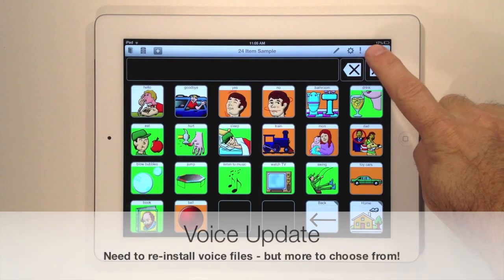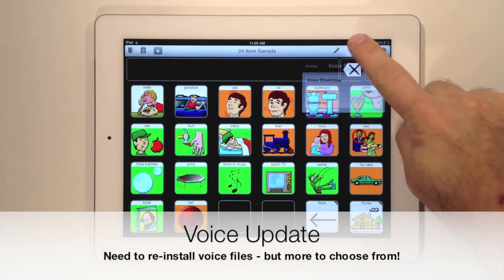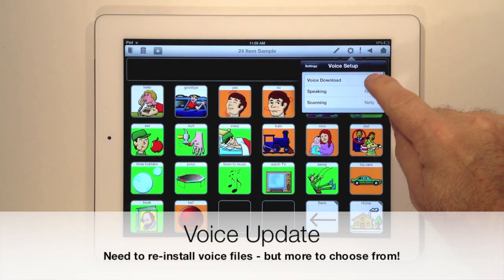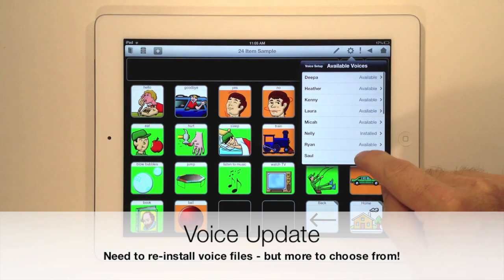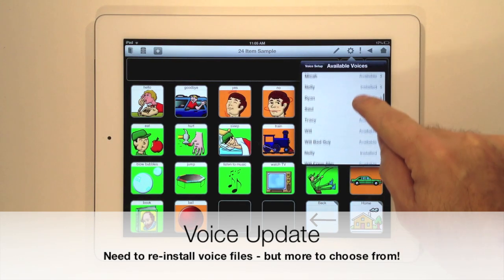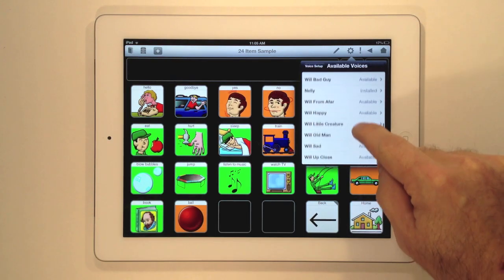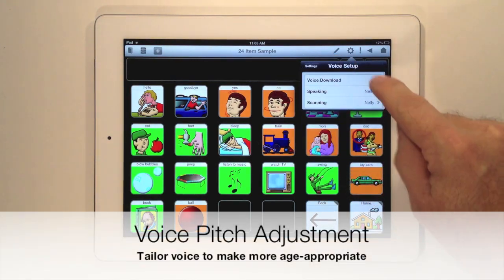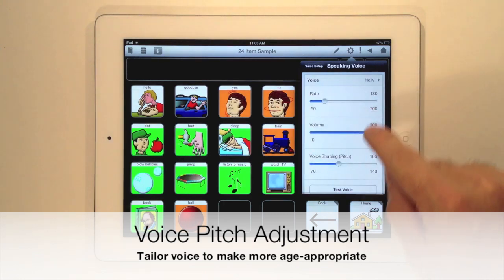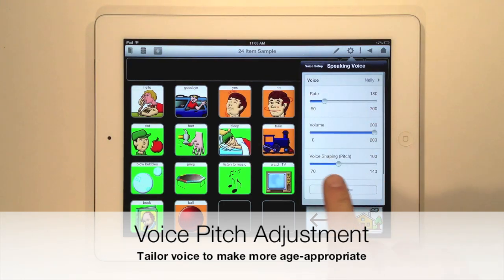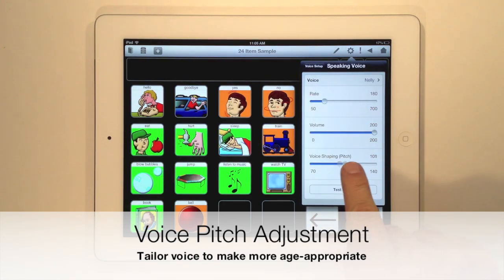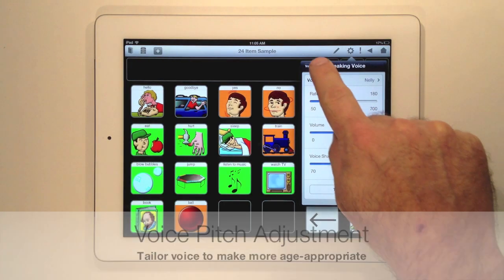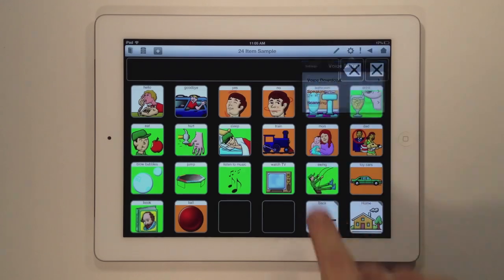With Tapspeak Choice 4.0, we've almost doubled the number of voices available to you and added eight more languages. You'll need to re-download any existing voices that you're using. There's also a new pitch adjustment tool that lets you tailor a voice to become more age appropriate.